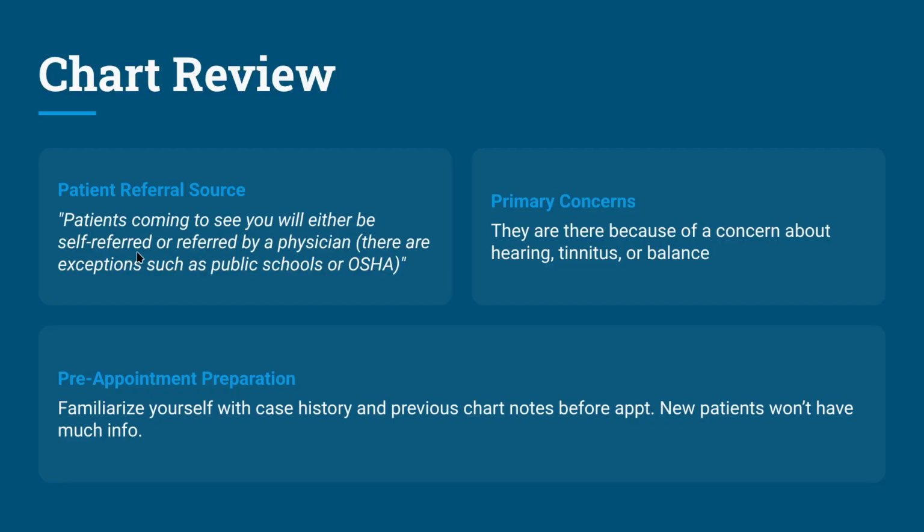And then pre-appointment preparation, you want to familiarize yourself with the case history and previous chart notes before the appointment. New patients typically won't have much info for you to review, but that's what you want to do before a patient arrives.